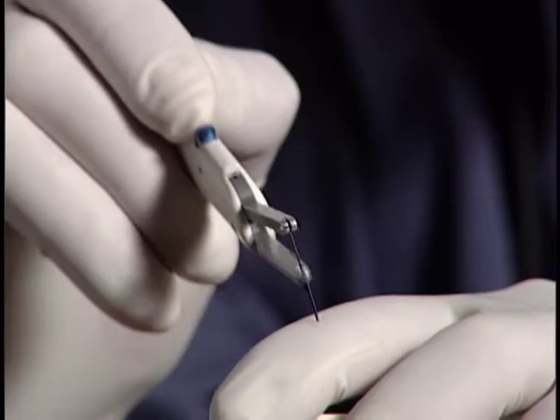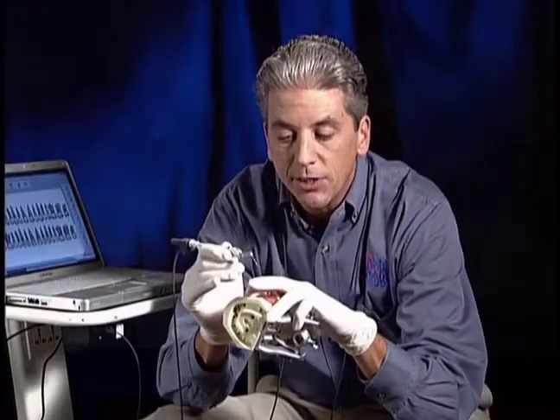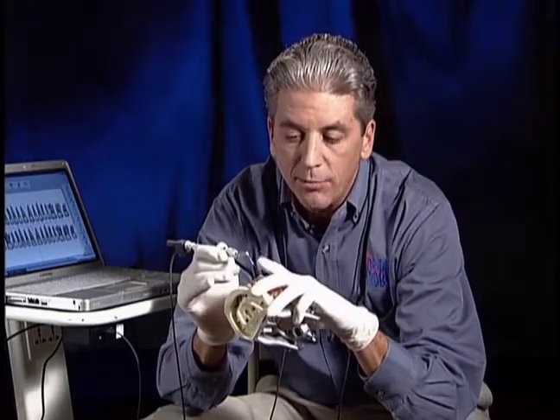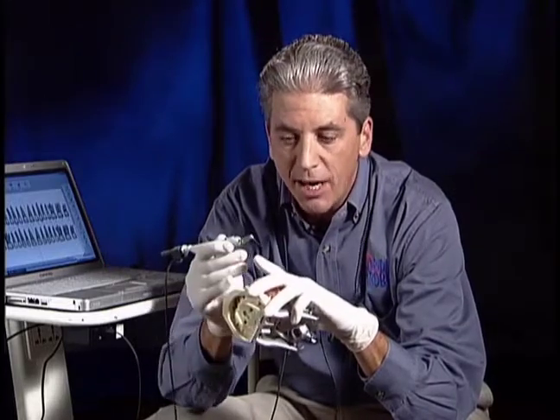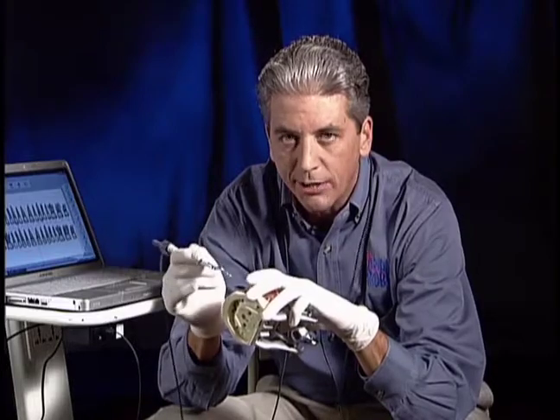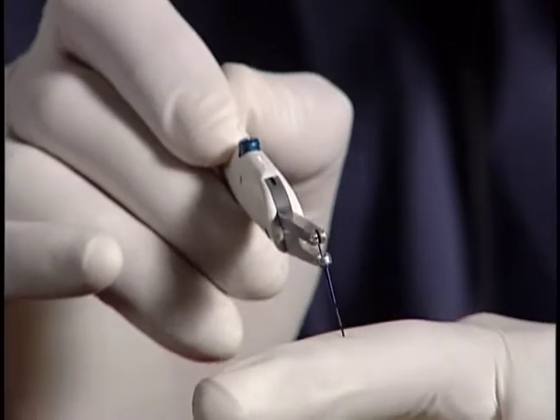It needs to be free floating. If it is bent, then I could be poking the patient. Similarly, sometimes during a long exam, saliva, blood, plaque can build up on it, and in my tray setup I might keep a cup of a minty mouthwash as a rinse and lubricant. First issue is a bent, kinked tip. It needs to be free floating.